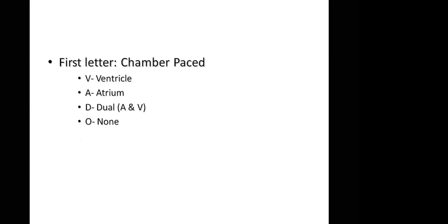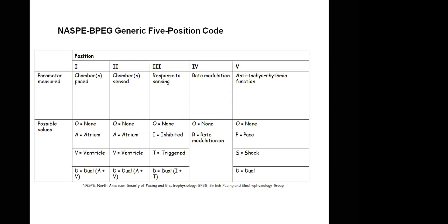Okay, so I got that if you're going to inhibit, it means that each time the pacemaker senses ventricular intrinsic activity, it doesn't pace, so it inhibits that. But for triggering, is it the pacer that triggers the intrinsic activity or what? I didn't get that. Because I think I got you saying it was supposed to be both pacing and inhibiting or something.